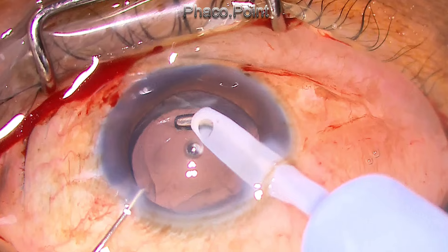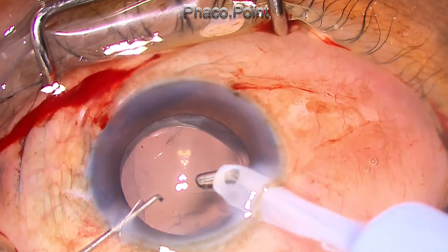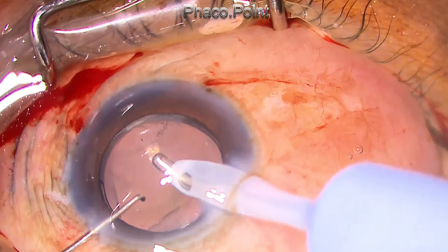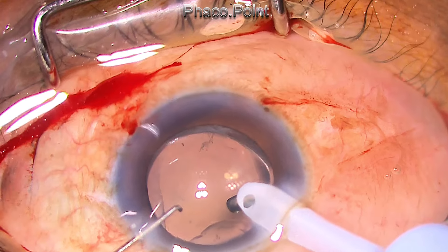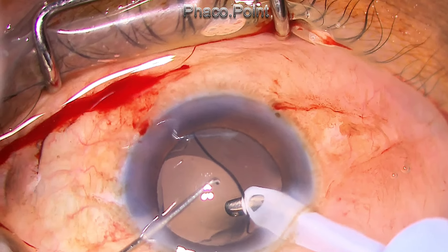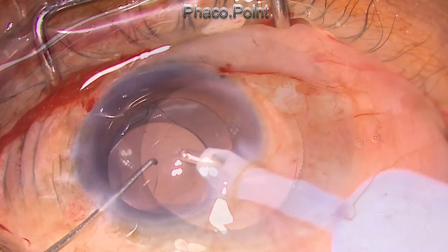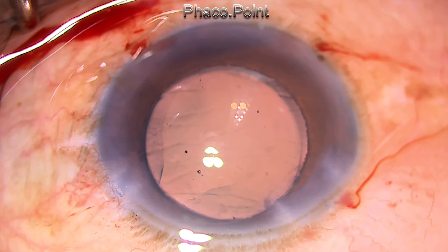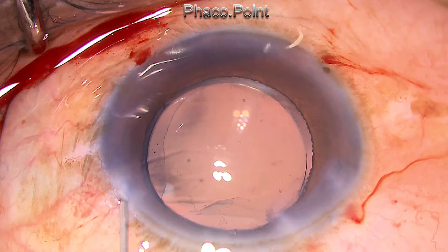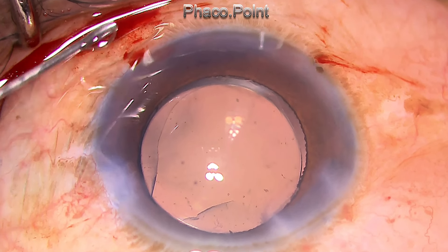You can see that the entire lens is beautifully sitting in the capsular bag. Of course, there is a single point of rhexis runoff. In the future, there could be some amount of capsular fibrosis, and there may be mild decentration of the lens. However, the EDOF lenses, especially ones like the Lucidus which utilize induced spherical aberrations to create depth of focus, will tolerate mild decentration as well. The case is concluded and the day is saved. Thank you very much for your attention.